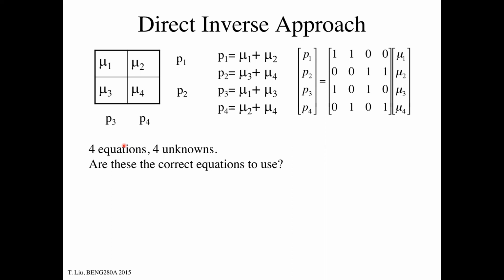And so essentially you image that every day just to make sure the scanner is producing the same picture every day, right? Fundamentally, what it is required for each day is to measure what water is producing in terms of X-ray attenuation.